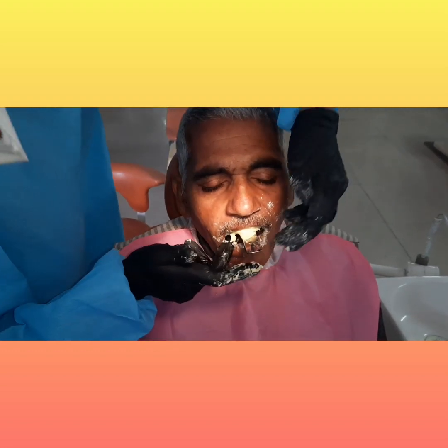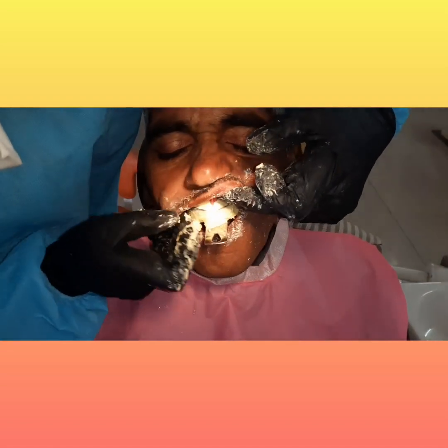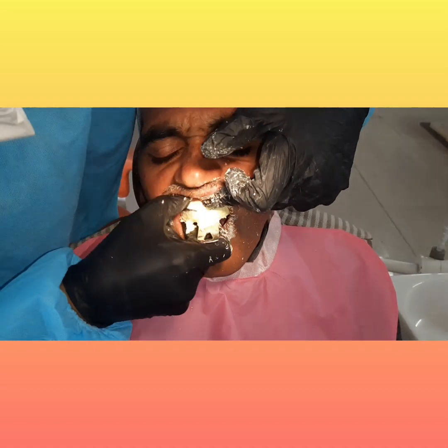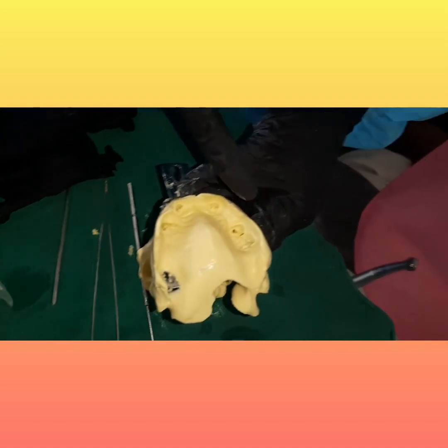The alginate impression is now set, so we can remove it — remember, in one snap. This is the impression as you can see. There is a certain area where you have applied slightly more pressure. In those cases, either discard the impression and make a new one, or mark this area on the cast and accordingly modify your impression trays.